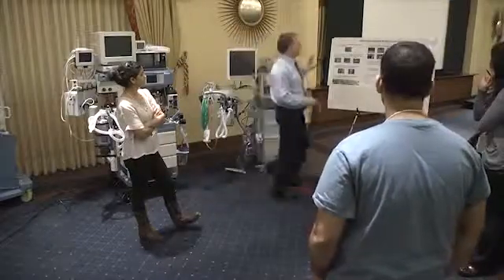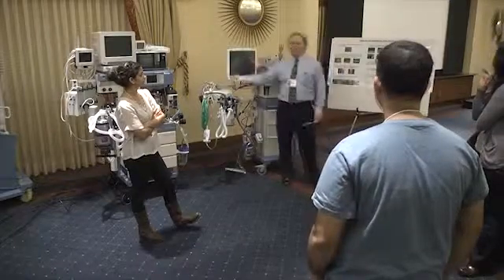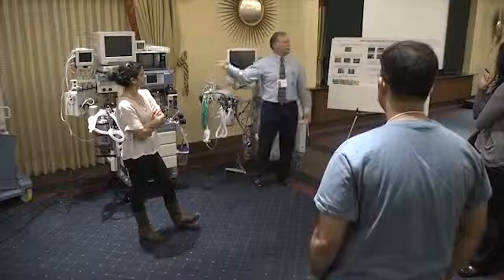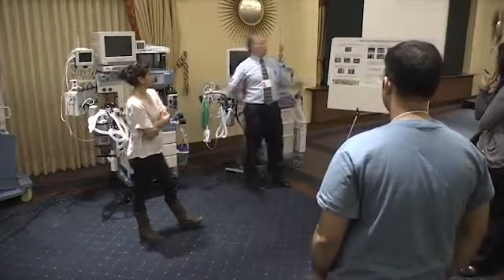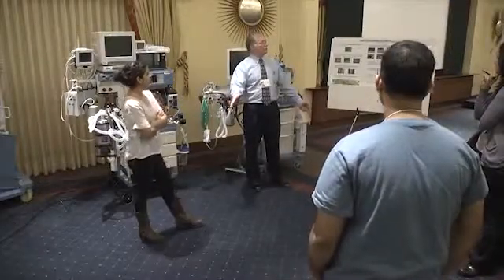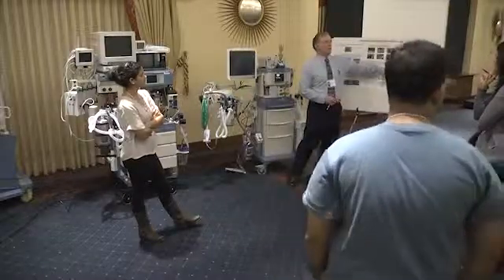And like I said, try to train somebody else to do this for you, because you don't want to come in and find out your oxygen tank is empty, your O2 cell is depleted, your vaporizers aren't filled, there's a leak in your machine. Heck, that's going to add a half an hour to your startup, right? You'd rather have your pit crew in there, do all that for you, find all the mistakes, and then you come in and just verify that this works. That's kind of the goal.